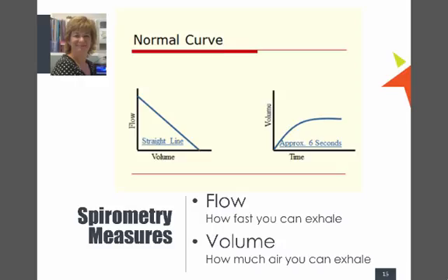And then drop down with the volume. So we're going to focus on this one. This is your volume, which goes up and will go along for about 6 seconds. This is more to do with restricted type diseases, and we'll talk about those and what restriction is, but I really would like us to focus on this one. I'm going to change my pencil to the red dot.